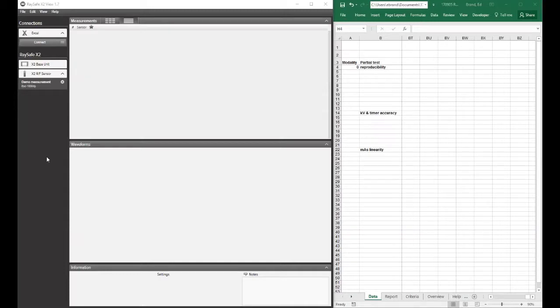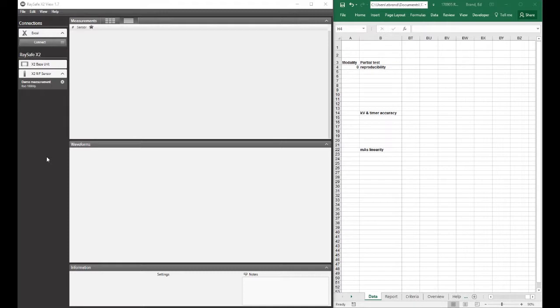Today I'm going to explain how to use X2View to export data collected from an ArraySafe X2 base unit to Excel.